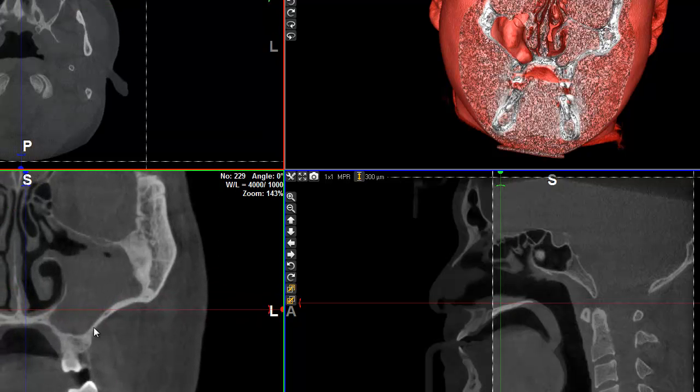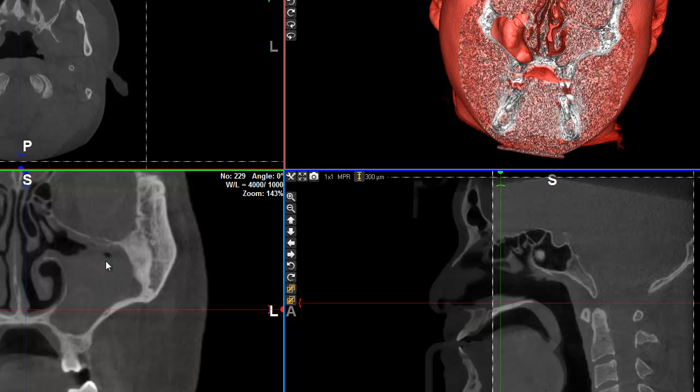We have here a patient whose Sinus is completely full. This is one of the great benefits of WhiteFox compared to a panoramic — what we call an OPG device — because you get precisely the soft tissue information that you don't get on a panoramic. In a case like this, if you were planning to do a Sinus Lift and you discover a Sinus that is completely full, the operation is simply cancelled and you waste your time.